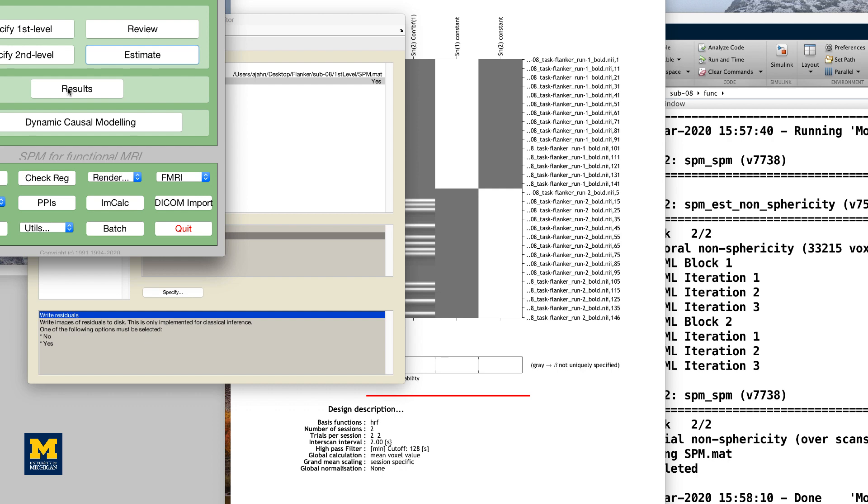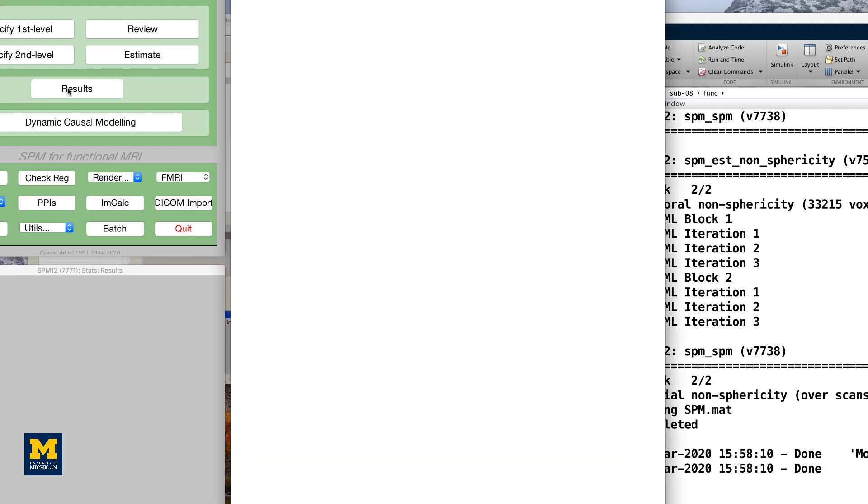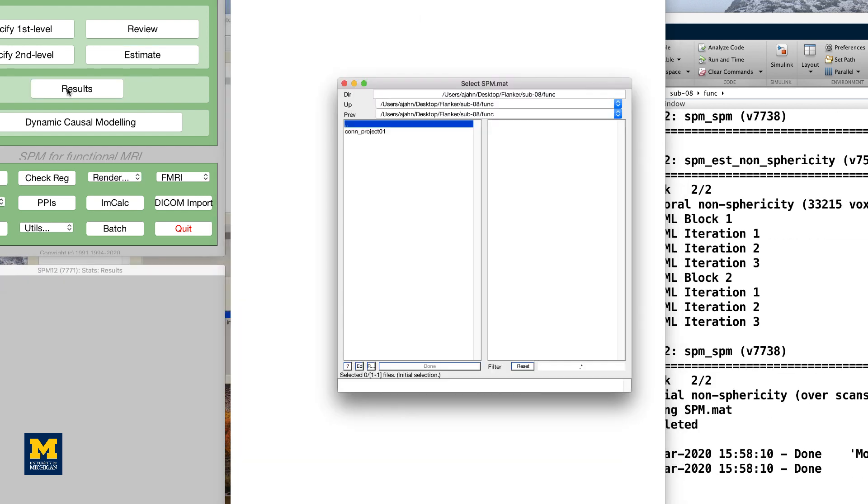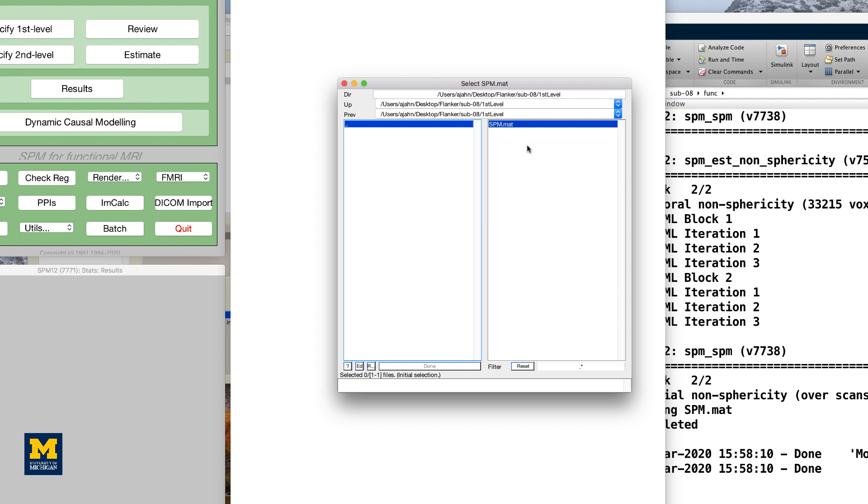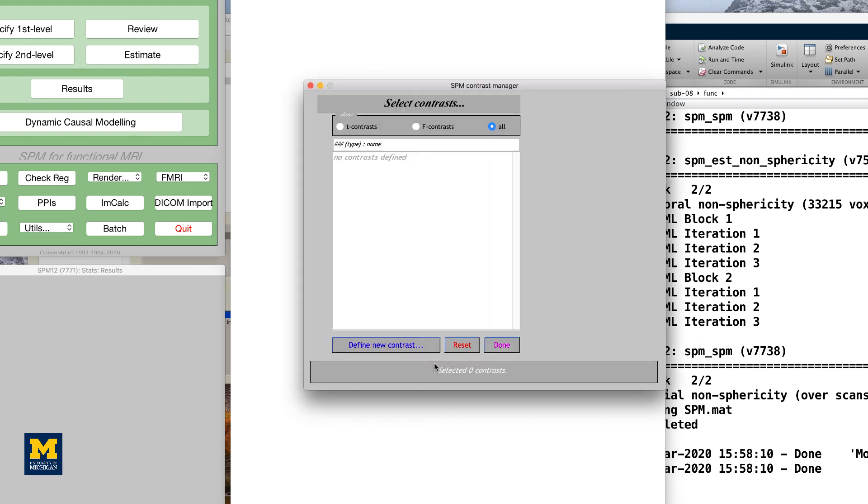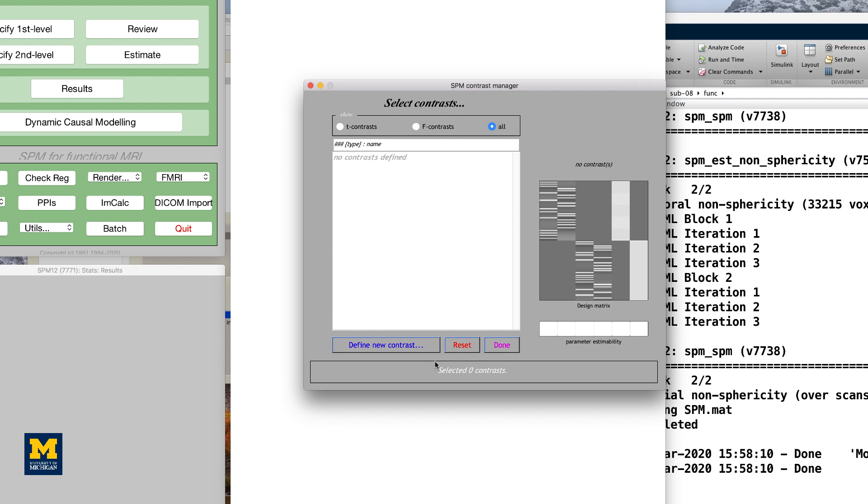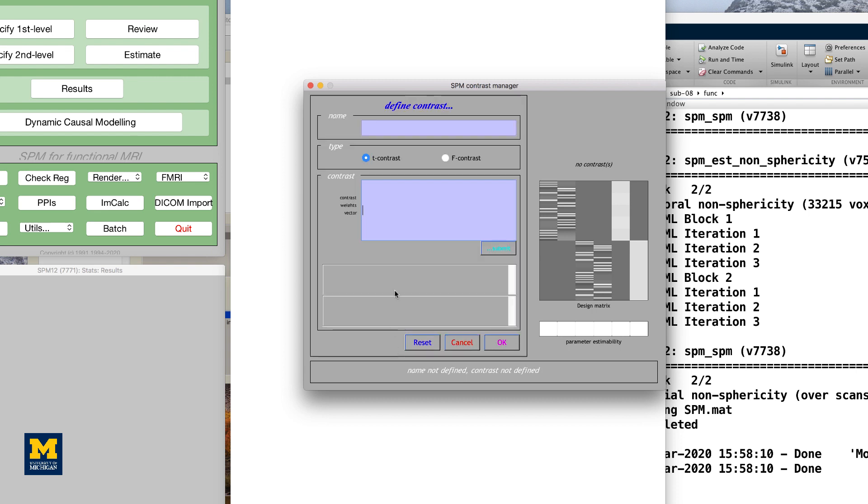To create these contrasts, click on the Results button of the SPM GUI, and select the SPM.mat file that was generated after estimating the model. You will see the design matrix on the right side of the panel. Click on Define New Contrast, and in the Name field, type INC-CON.